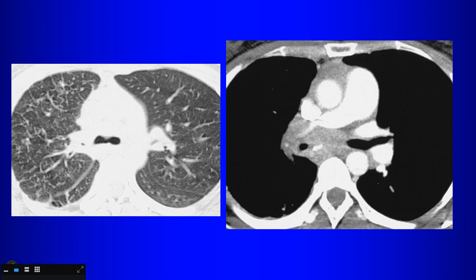Because of obstruction of the pulmonary vein, right. So you can have asymmetric or unilateral pulmonary edema with fibrosing mediastinitis from obstruction of the pulmonary veins on that side. But before we see the CT chest, can we put PE on the differential?